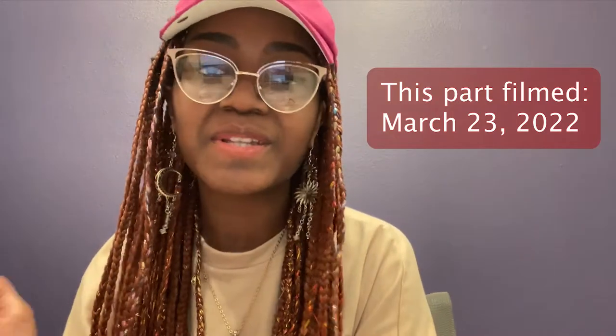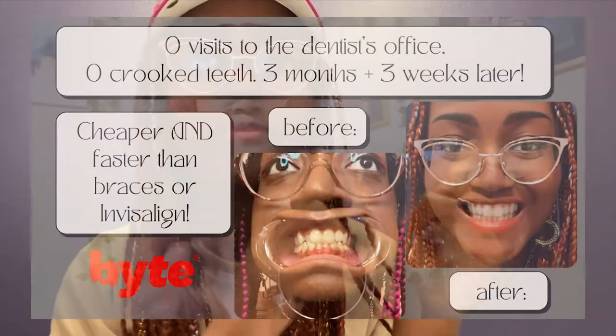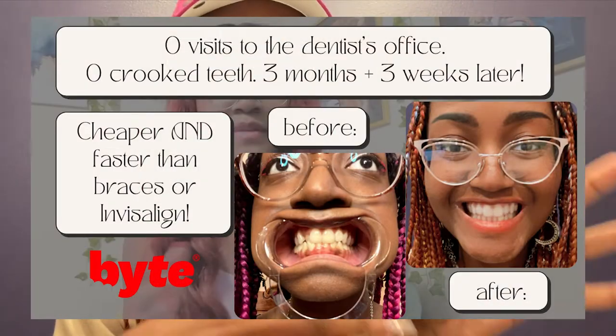One month later — hi, this is me in the future after I have completed my treatment with Byte. I just wanted to hop on here and give you guys some extra tips on how to use it effectively. Make sure to watch through the end of this video as well as the video I did right before this for some additional tips on how to use the treatment to the best of its ability.